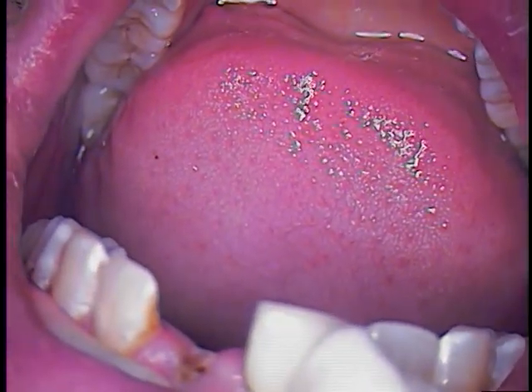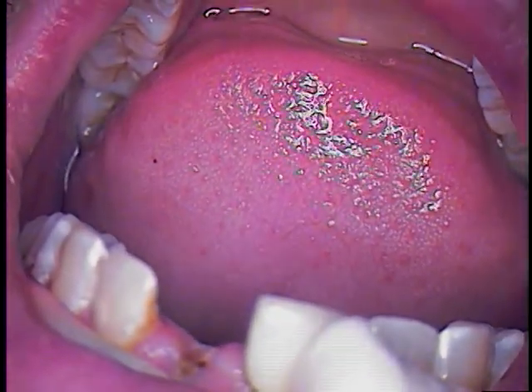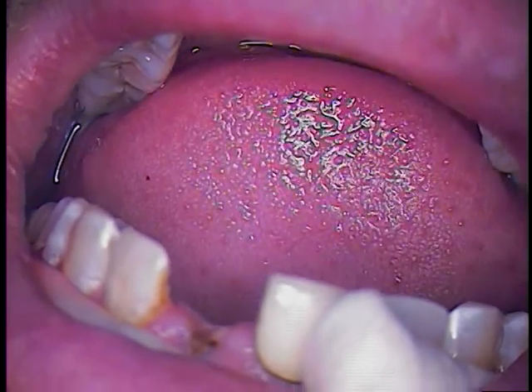See if we got the right diameter. Hold on, folks. I'll be right back. I'm going to see if I can get my calipers out. We'll check the diameter.